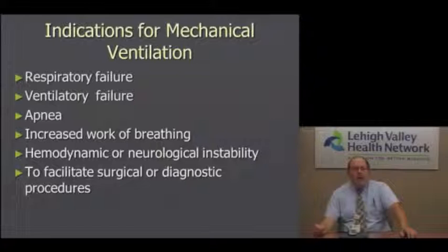We ventilate a lot of patients for hemodynamic or neurological instability, and obviously at a network like this there's a lot of surgical or diagnostic procedures that require the patient to be completely sedated or completely immobile, and a lot of times they'll need mechanical ventilation because of the anesthesia for the procedures. There are probably other indications for mechanical ventilation, but I think this cuts across the majority of the patients that we see.